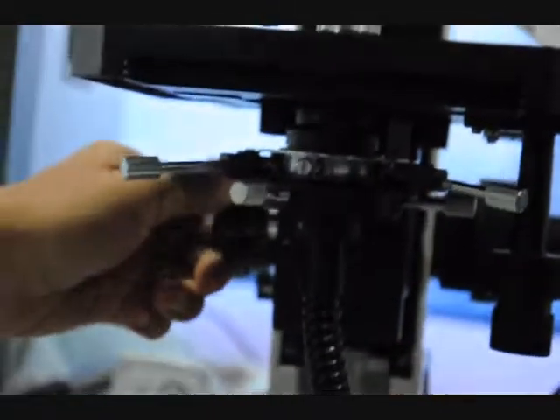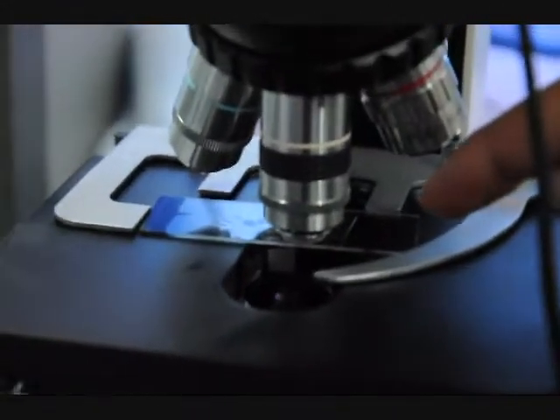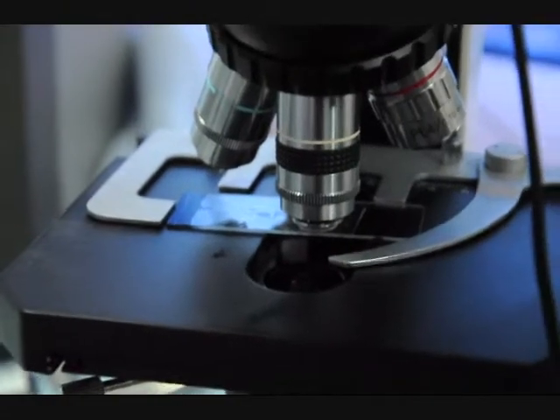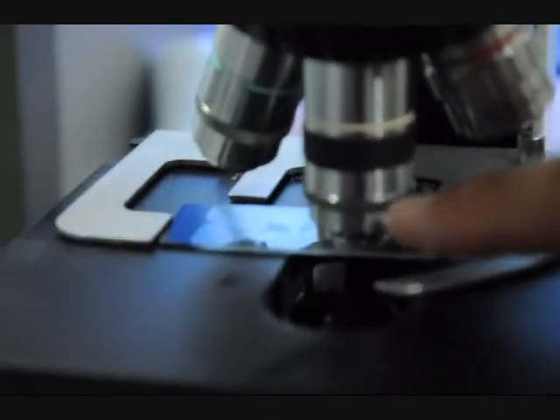We've already taken a live blood specimen here. We've got just a little tiny drop of blood. Don't put much blood. If you put too much blood, you won't get a good image. Just a small amount of blood, put oil on the top. We've got a 100x oil immersion objective. This is the iris diaphragm.